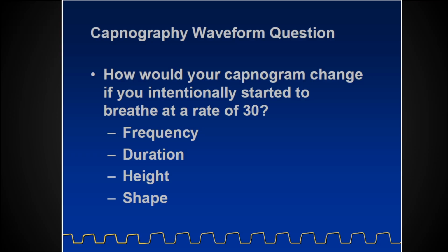No, and that's kind of my point, is that we're not going to see shape change until we're starting to get pathological obstruction issues. You would be okay saying, I don't know anything about end tidal waveform except for this: it goes farther away from a rectangle and closer to a shark fin when you have bronchospasm or bronchoconstriction. And I would be like, great, that's the most important thing you need to know.